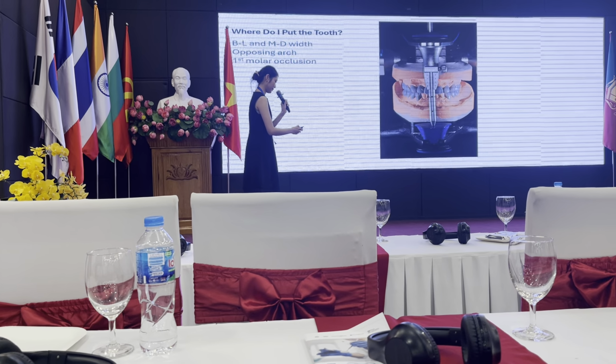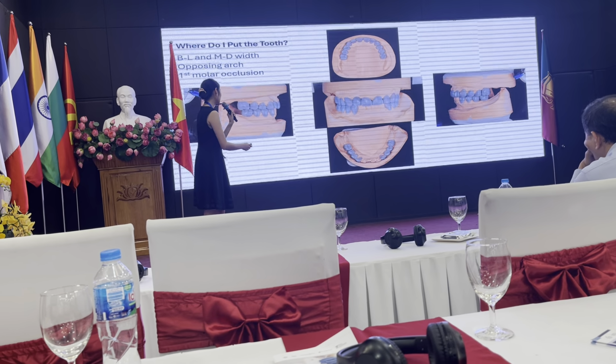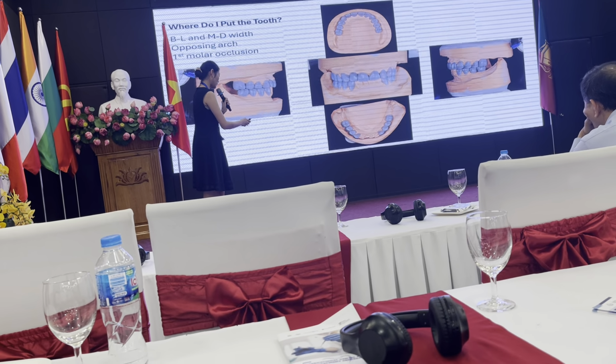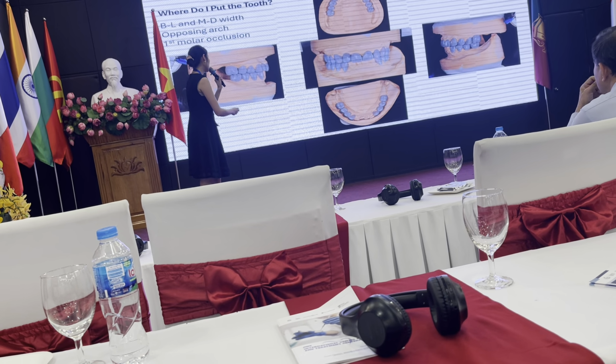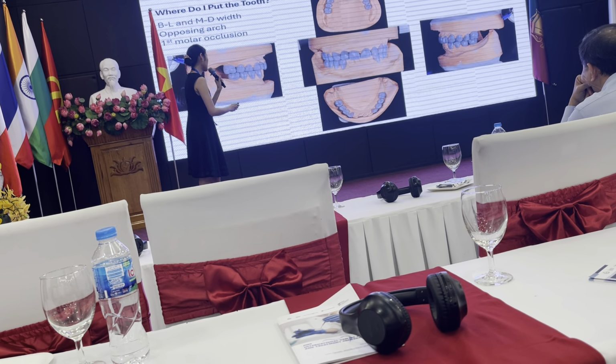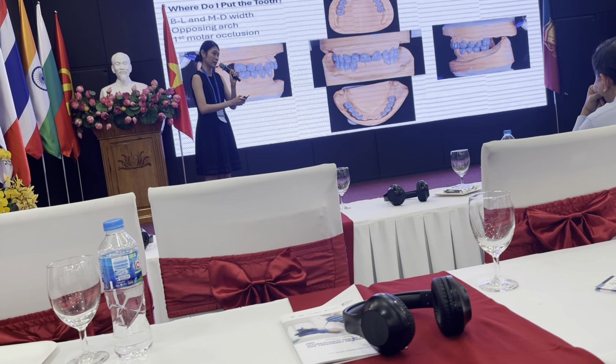We will calculate how much prosthetic space we have. So in that sense, you can get the ideal cusp fossa relation for the mandible and also for the maxilla, so you can achieve the ideal overjet. So that's how we do that in the analog workflow.